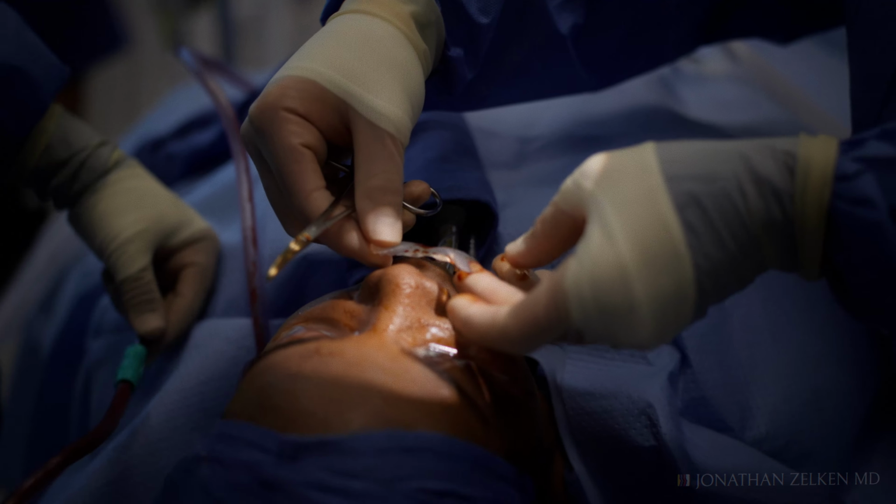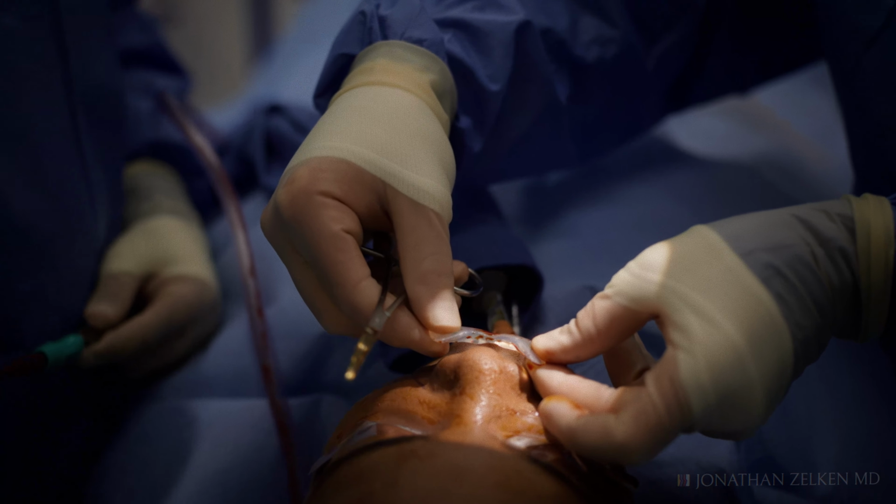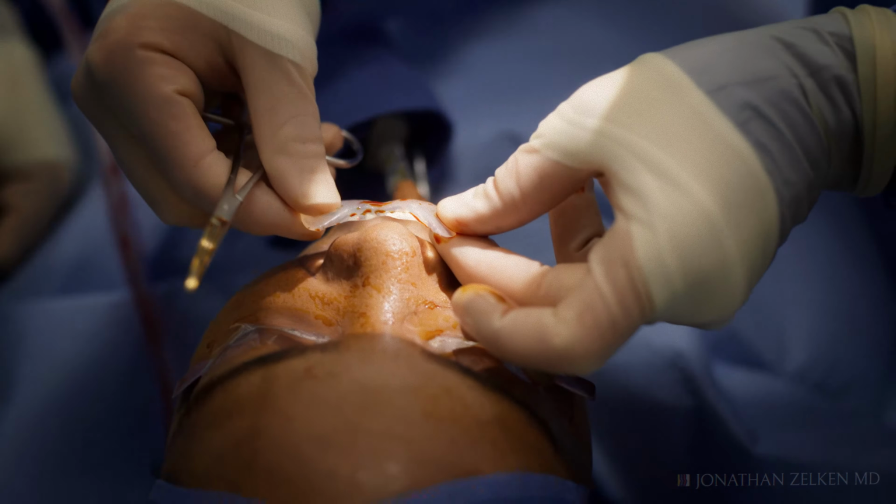Now, silicone implants seem to carry the market share. When you think of facial implants, we call a company and oftentimes we'll get an off-the-shelf option that fits most patients. And we can cut it down with a knife or some scissors and optimize the shape of that implant, but the reality is I'm finding that custom solutions with plastics, thermoplastics specifically, have been better.